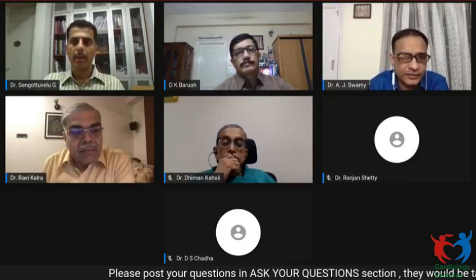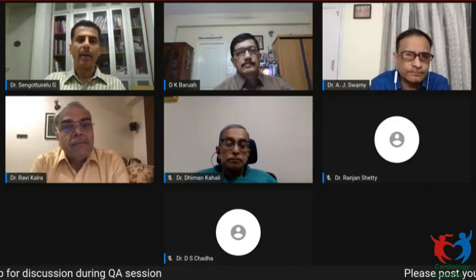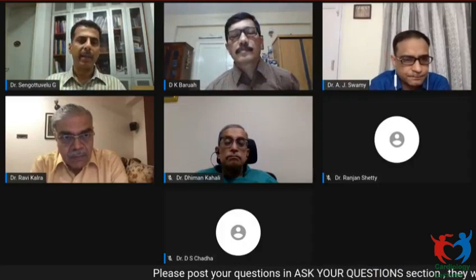Now, Dr. Ajay, I just want to ask you one specific question. This patient has an MLA of more than 7 square millimeters. We can leave it alone. So, yeah. Leave it alone. Don't need any other investigation. But I just want to add one comment.